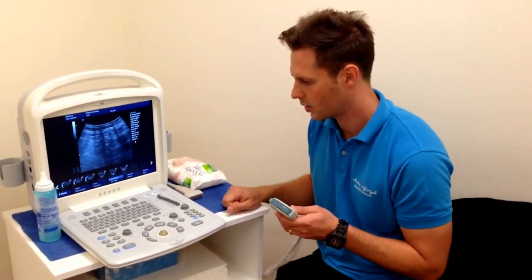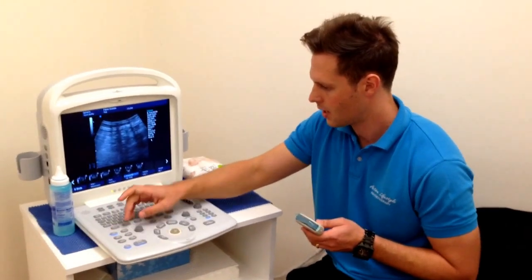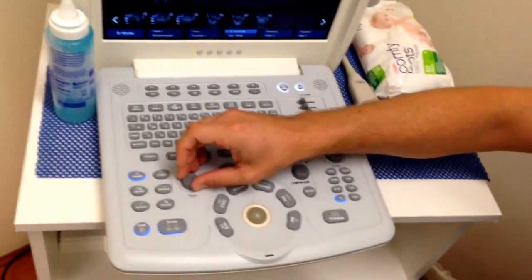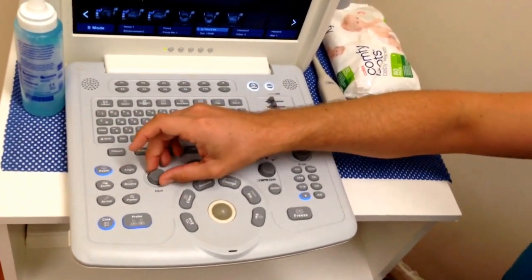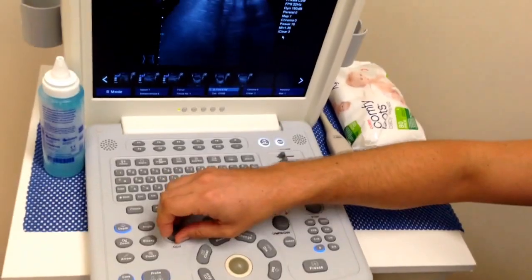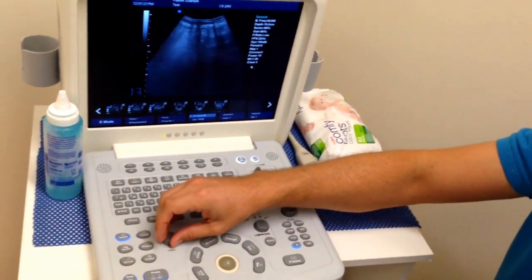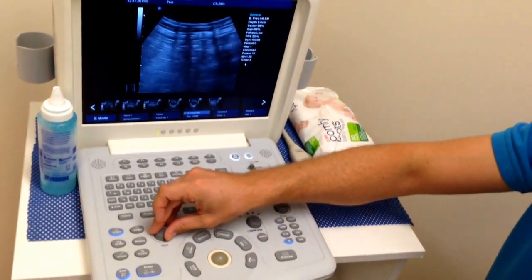Let's have a quick look at the machine. First of all, let's have a look at the depth button. The depth is pretty self-explanatory — changing the depth button on the machine, it'll be in different places on all different machines, but basically we can zoom right in and zoom right out as well.